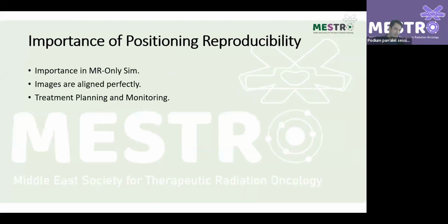And in the next slide, he mentioned that positional reproducibility has a great role for MR-guided radiotherapy. If our setup is very accurate, then images will also be very perfect. It also has a very great role for treatment planning and monitoring.